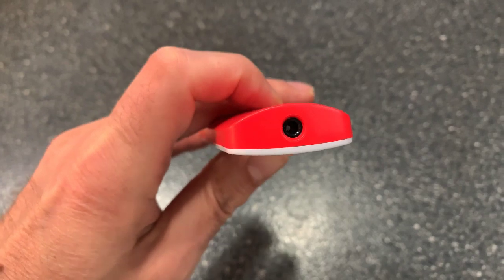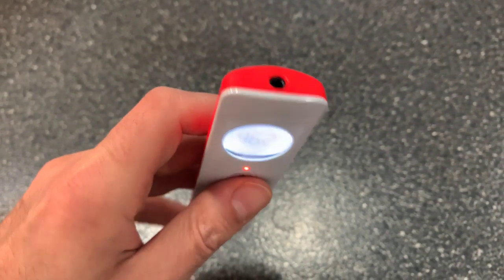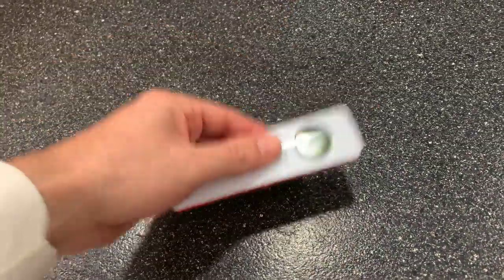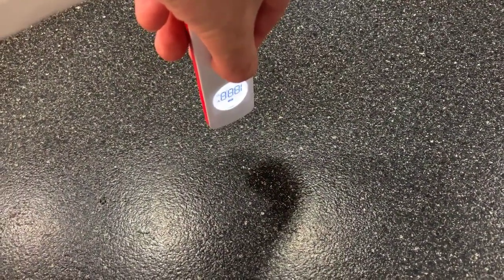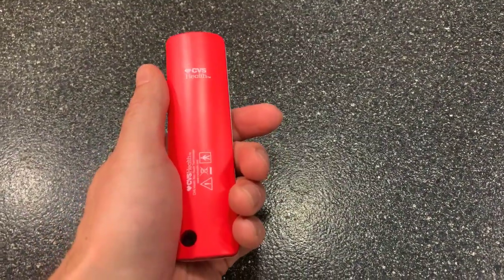Here's what it looks like from the sensing area — you're going to just kind of put it like this. If the table was your forehead, all you have to do is go like this, hit the button, and then it would tell you the temperature. Really cool device, kind of blew my mind.